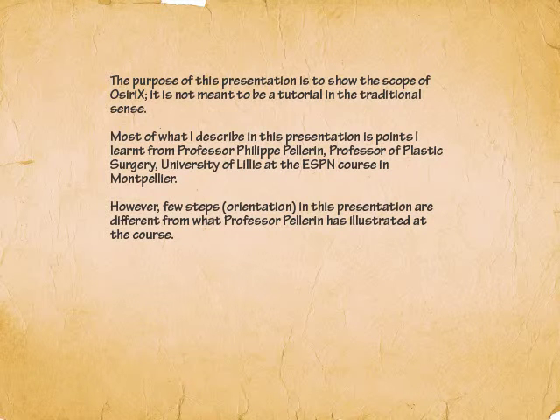Much of what I am going to demonstrate to you in this presentation comes from my learning of OsiriX from Professor Philippe Pellerin, Professor of Plastic Surgery at University of Lille, France, at the ESPN course in Montpellier, which was held from 3rd to the 7th of June 2013.